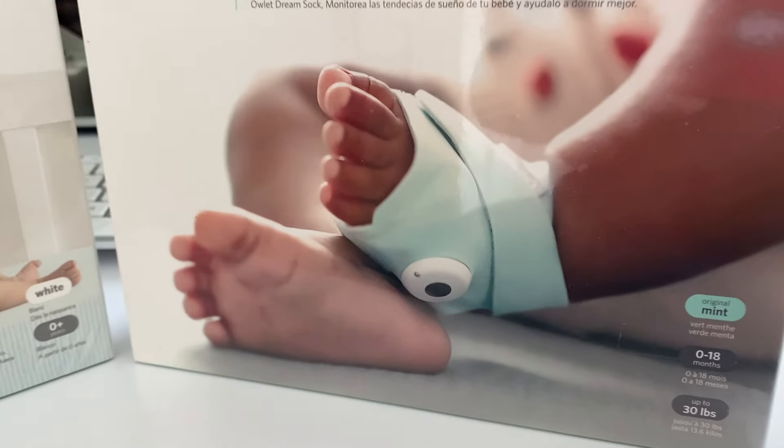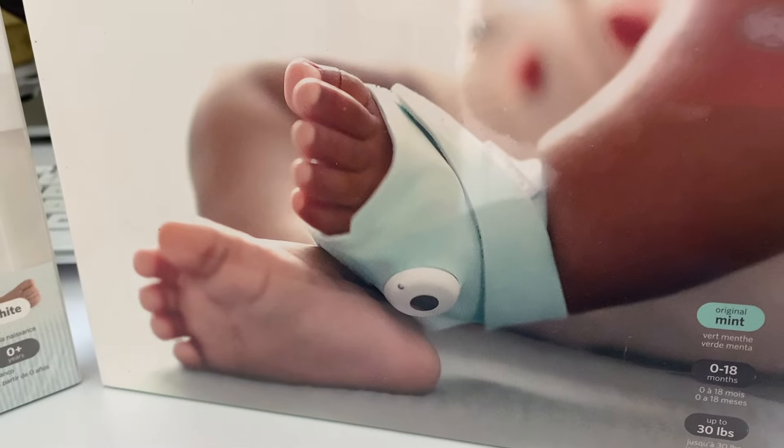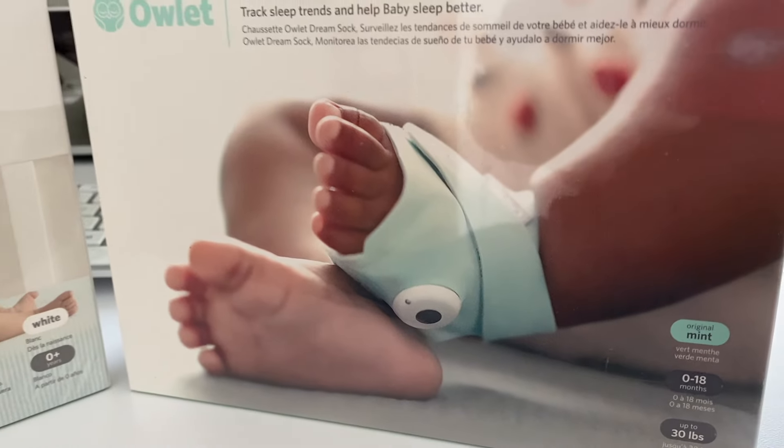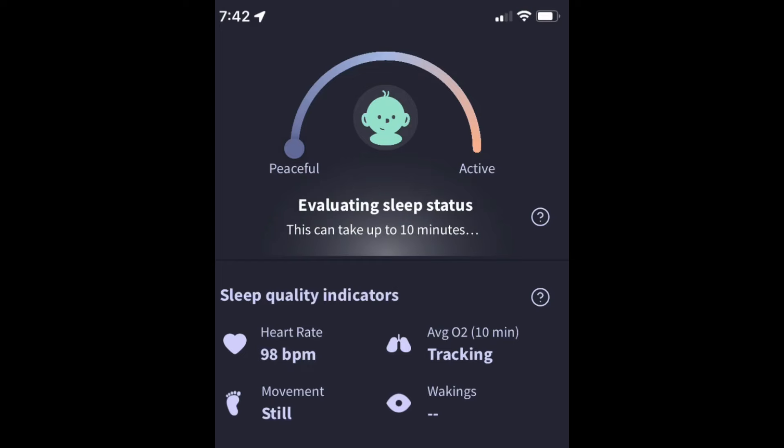The Owlette Dream Sock is a baby monitor that offers algorithmic data collection to give more insight into what's going on with their sleep. It comes in four different colors. Essentially the heart of this is the data collection, and evaluating the sleep status is the key to it.